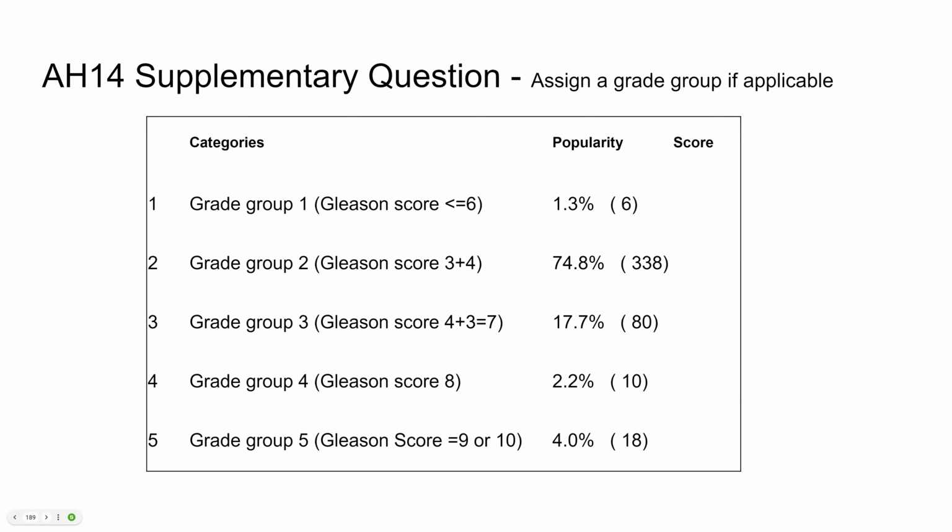Gleason pattern 4 alone is an interesting one, whether people would accept that to be a half mark, because it doesn't take into account the 3 that was definitely there. And Gleason grade group 5 is whether you take that to be a little focus of pattern 5, which is a few Gleason groups away from our preferred diagnosis, so that might be more unacceptable. So that's how we consider the Gleason grades.